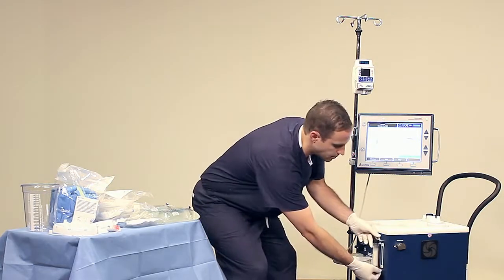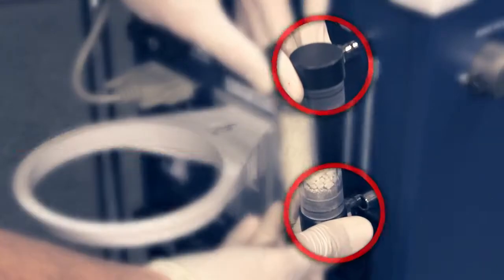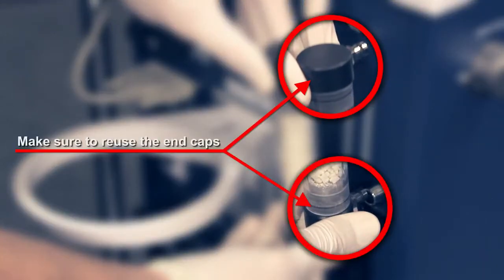Replace the soda lime column with a new one from the accessories kit. Make sure to reuse the end caps.